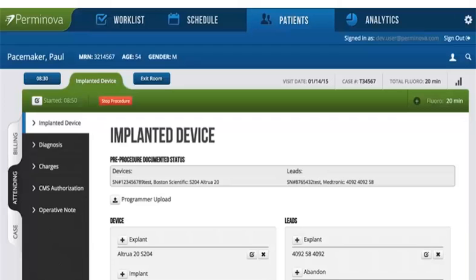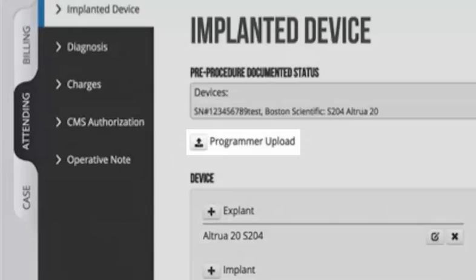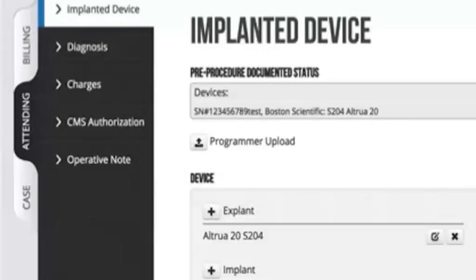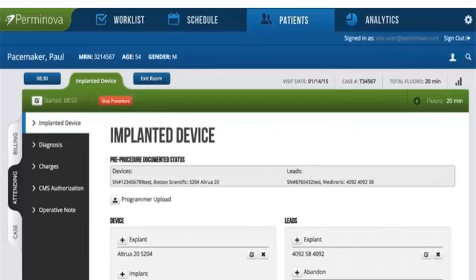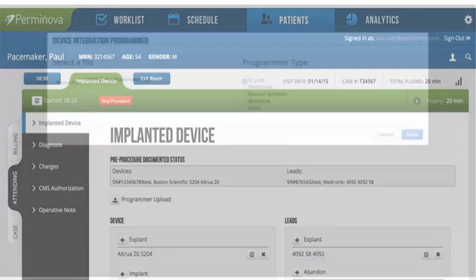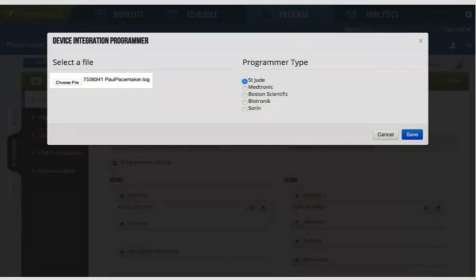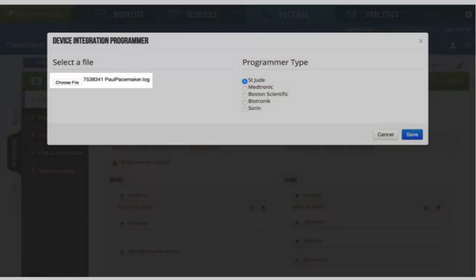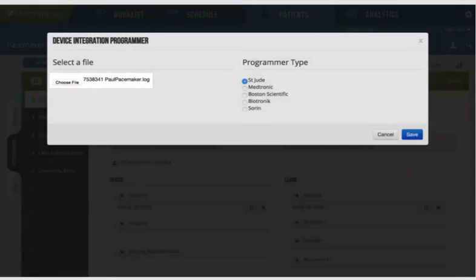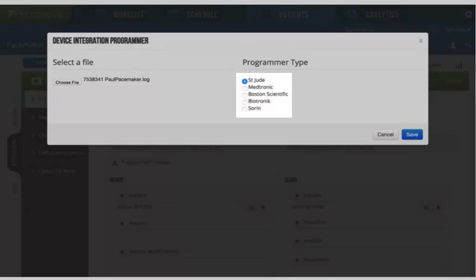Our new upload function allows users to click the Programmer Upload button to pull in relevant details for device cases. Choose the file from the programmer that you want to upload and tell the software which programmer you are uploading from.